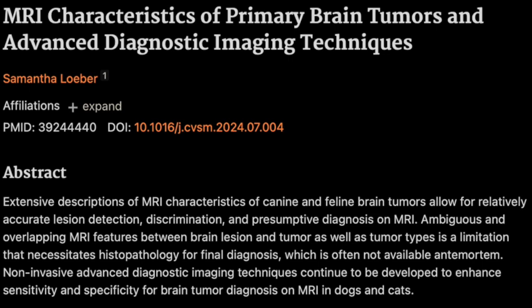Another thing about meningiomas is that they often light up brightly with a contrast dye. So you inject something into them. We inject it intravenously before the MRI. Why is it important if it lights up? Well, bright enhancement usually means there's a good blood supply, which is important to know when we're considering treatment. So brighter is usually better in this case? It can be. But every tumor is unique, of course, and treatment decisions are always made on a case-by-case basis.